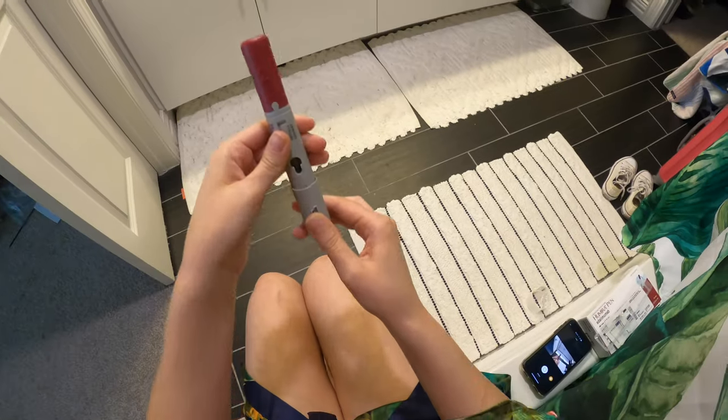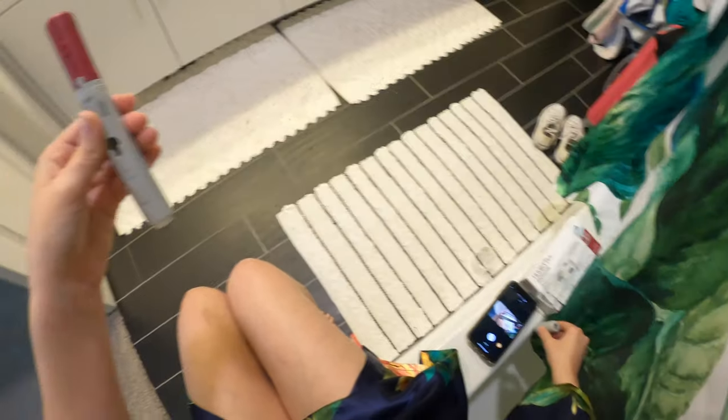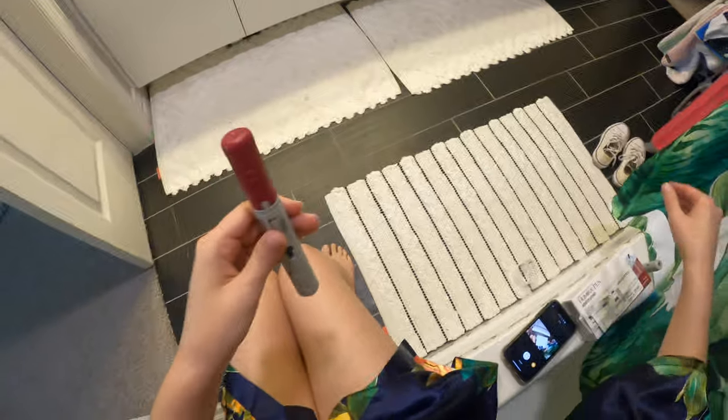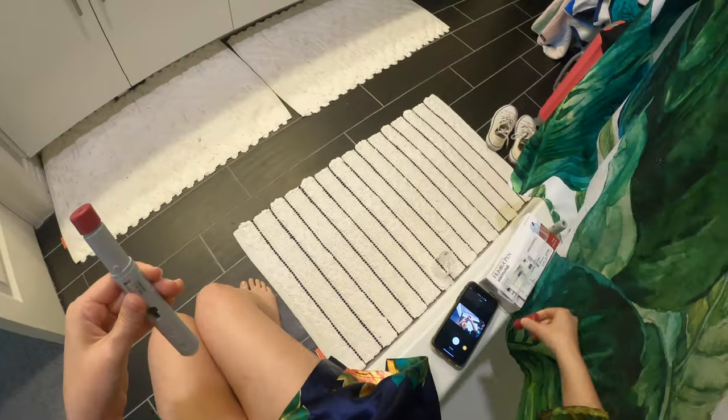So take off cap one. Ever since I've got it, little drops fall out every time I take off cap one. And then you take off cap two, exposing the button.